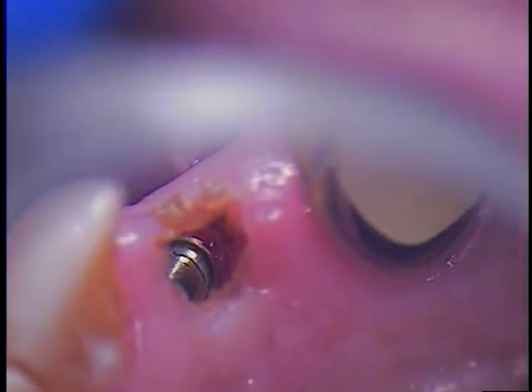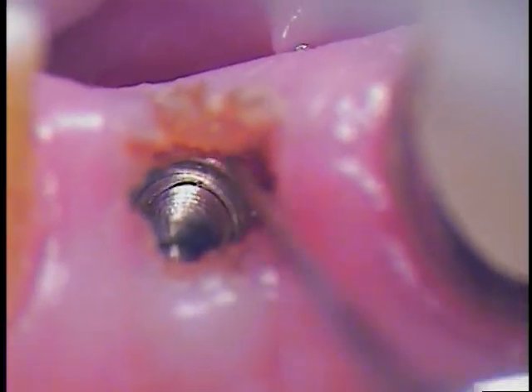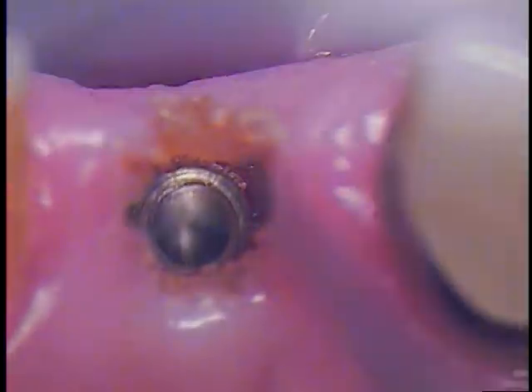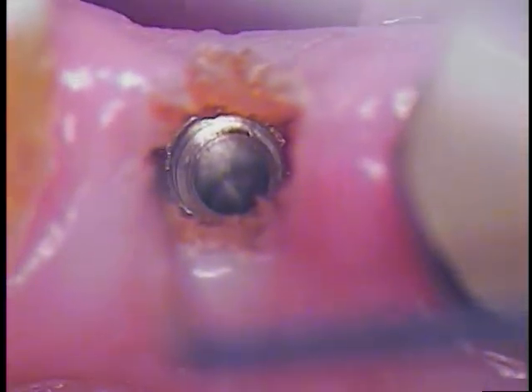Okay, I'm going to look internally for a moment. Here we go. Let's see if this is two-piece or is it one-piece. Searching, checking. Now we take the Endo Explorer and see if there's any movement to it. Good. Now you can see the wearing of the outer lip. I see, yeah. But the threads are intact, though. Threads are intact.